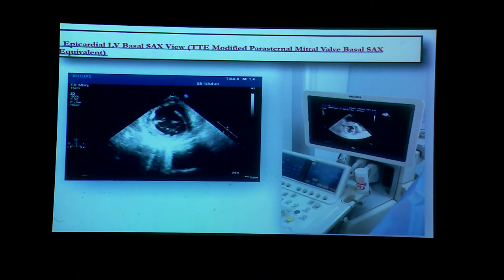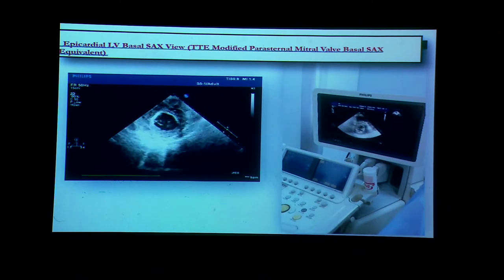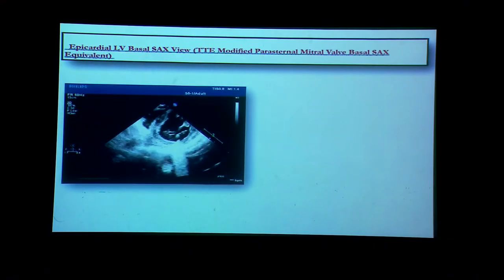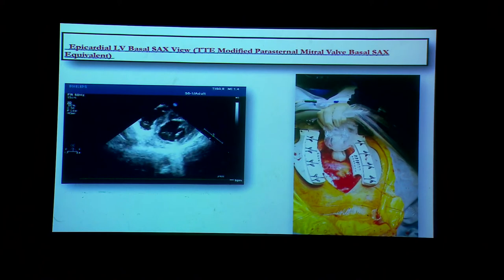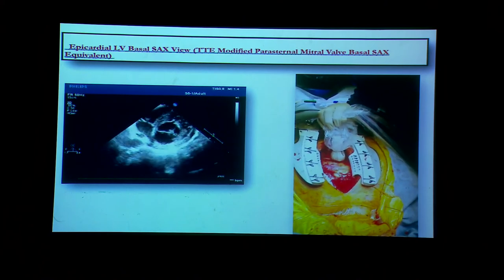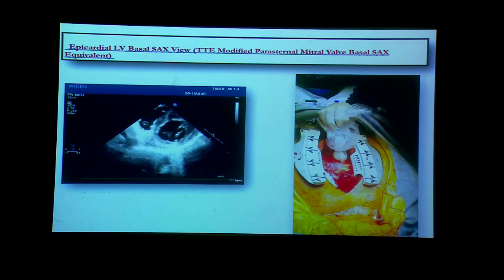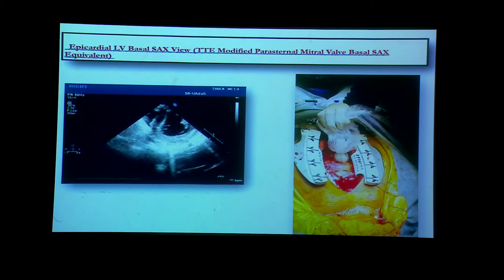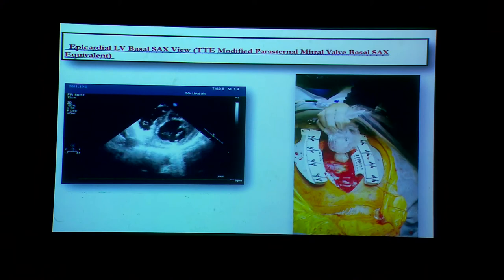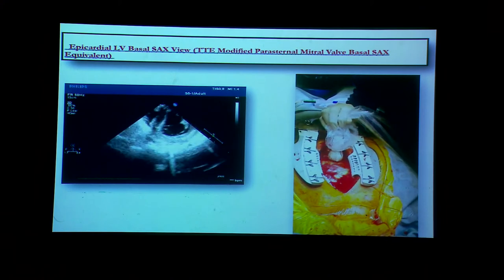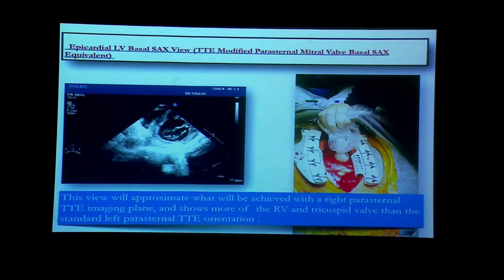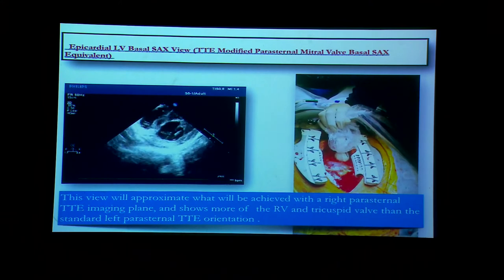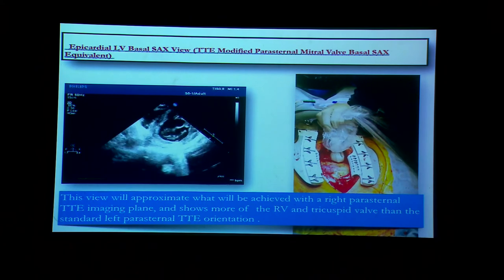This view can be modified. By tilting the probe more towards the right ventricle side instead of the left, we can see a major part of the right ventricle — giving us the right ventricle short axis at the basal level. This view is also very important for evaluating the tricuspid valve, and it has a left parasternal transthoracic orientation — similar to the left parasternal transthoracic view.